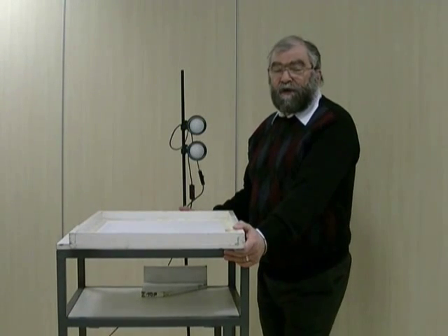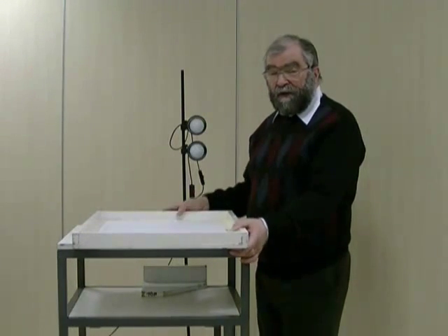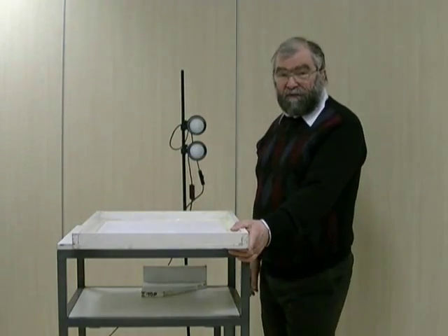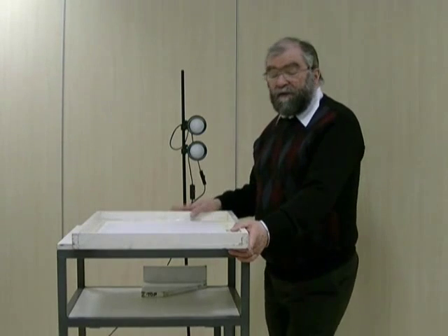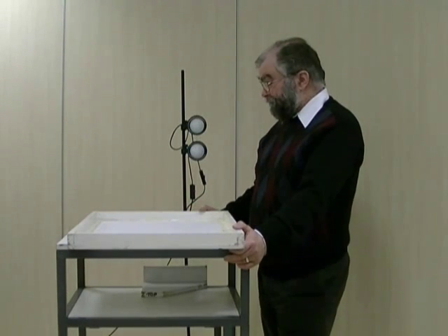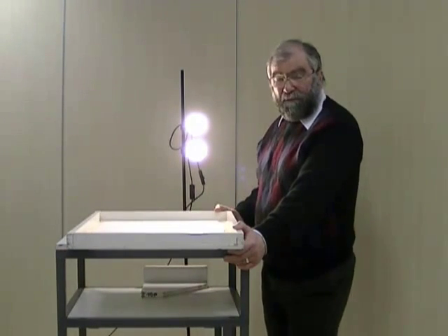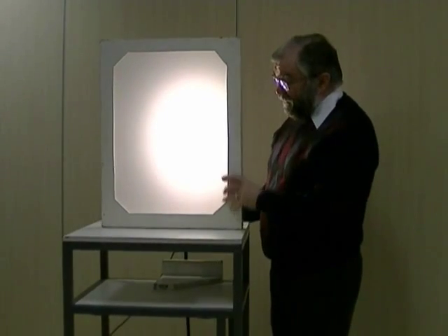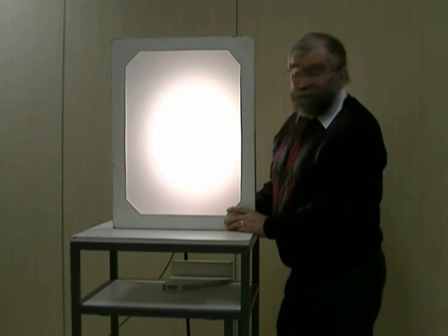This little demonstration is intended to illustrate some of the properties of a pinhole collimator used with a gamma camera. Instead of a source of gamma radiation, we're going to use two light bulbs as sources of visible light, and instead of the scintillation crystal of a gamma camera, we're going to use this translucent screen for detecting the light. So if I turn on my two sources, we have radiation emanating from them in all directions, and if we put the detector represented by the crystal here in front, we see that we don't get any image at all — just a general spread of light all over.